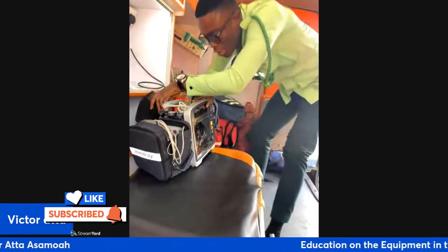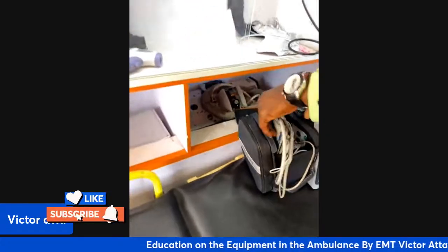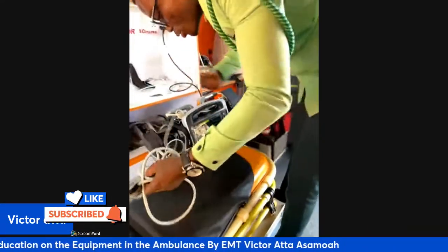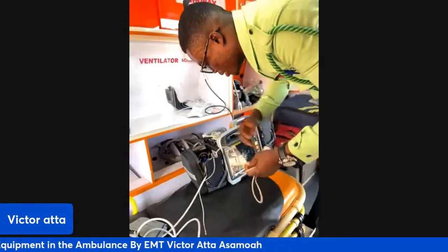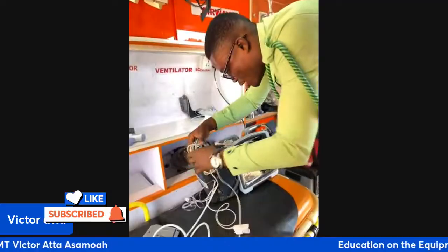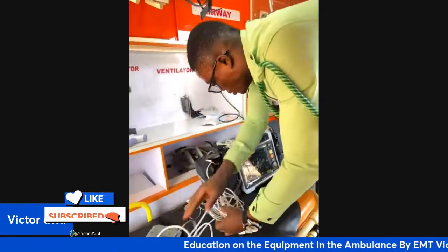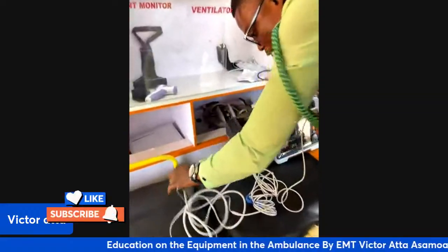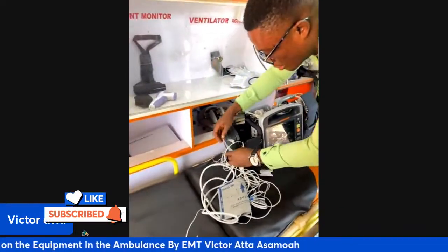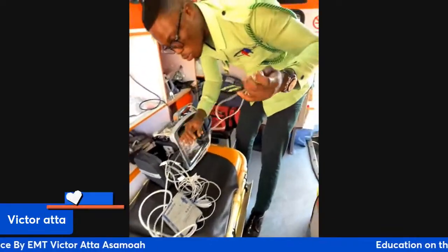So we have the electrodes, the BP cuff, the pulse oximeter, and then we have the temperature. This is the temperature. This is the pulse oximeter. This is the BP cuff. And then we have the CO2.